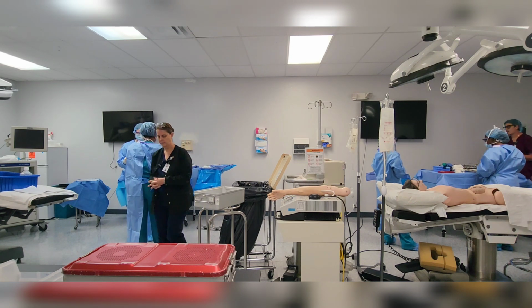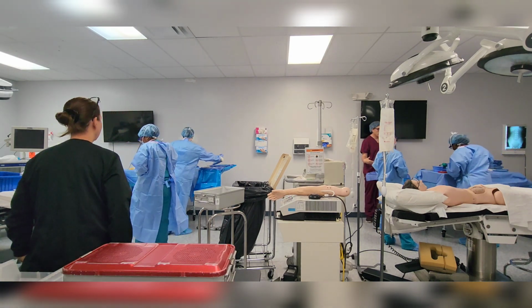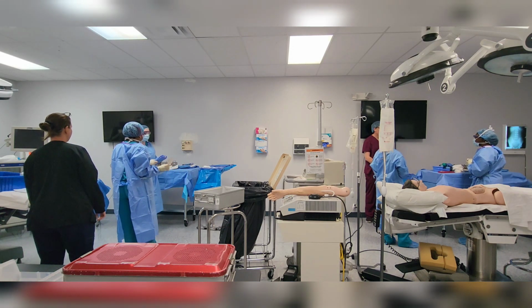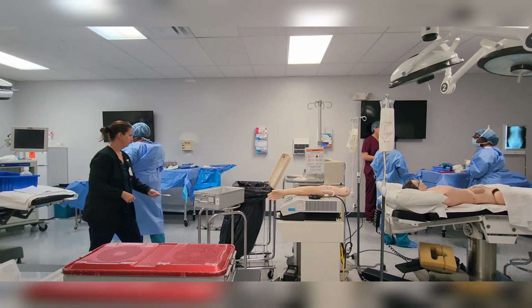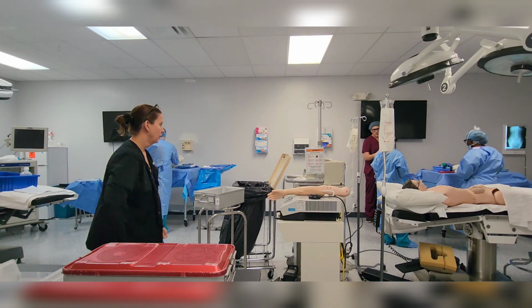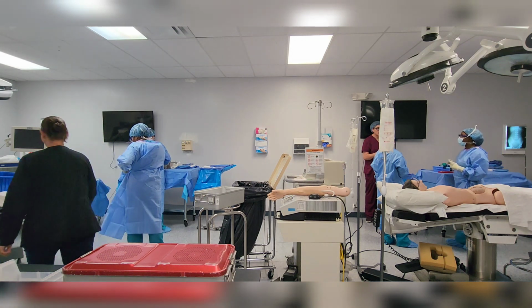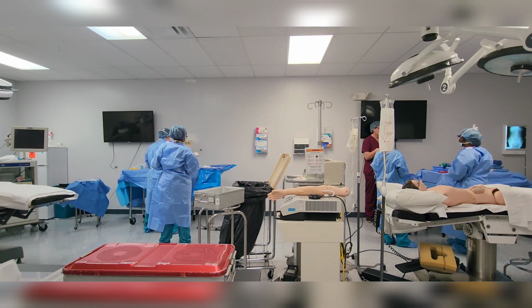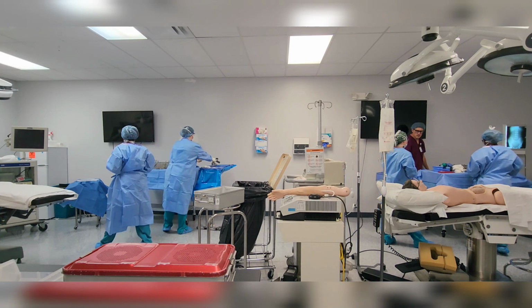Perfect. So you guys want to set up, you guys remember how to set up for that appendix case or any in general? Or you did that. So up here, I gave you your Mayo pack. Set it up any way you want. Put some instruments up here, and then what we're going to do is drape the patient. All right, okay? I'll go in with you. So you guys can work together, put some stuff up there, a little variety of things, and then we're going to get there. I want to see some ties passing. I also want to see how you pass some instruments, okay? I'll give you a couple minutes to kind of work together on that.